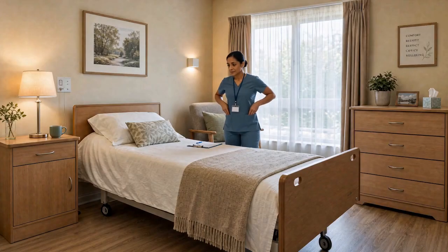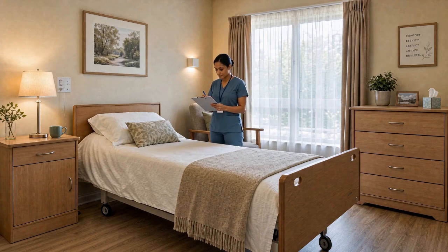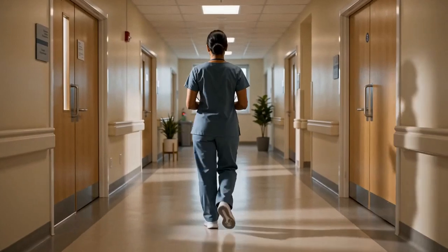Before checking blood glucose or assisting with insulin, verify the resident's identity and review the current orders. Confirm when the glucose check is required and whether it is related to a meal. Pay attention to the resident's condition.